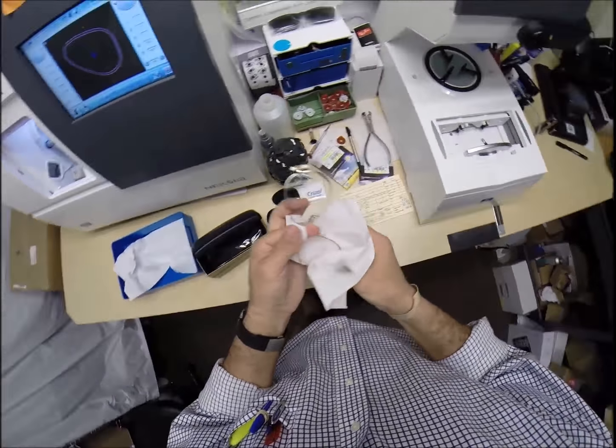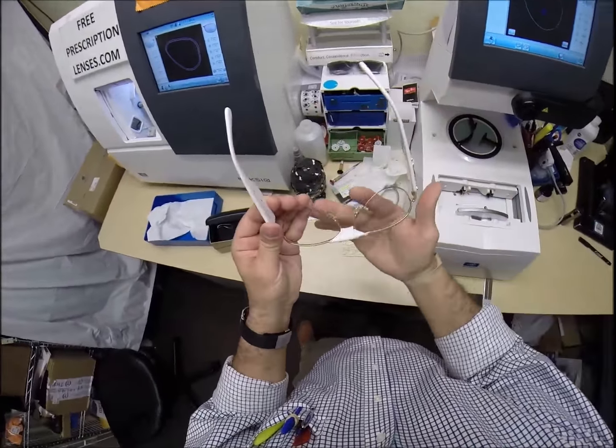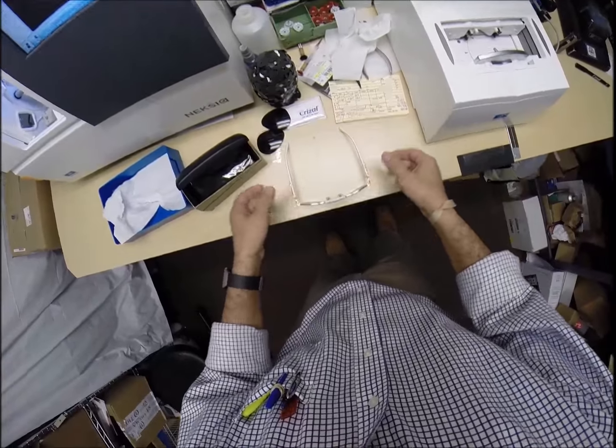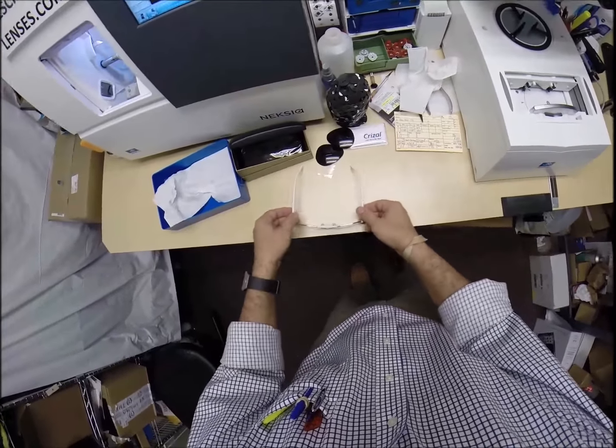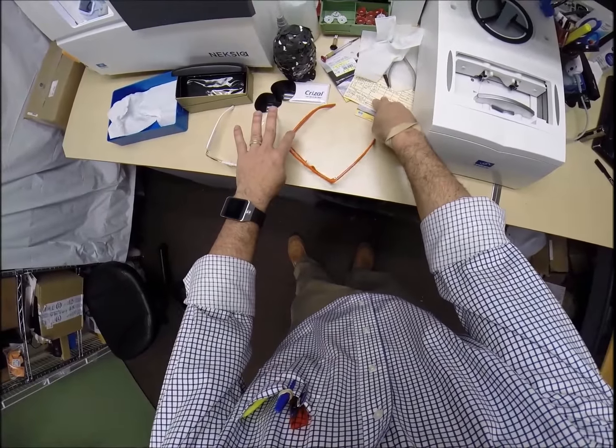But I'm going to get them in standard alignment first, also known as the 3-point stance. The 3 points are 1, 2, and the bottom of the frame being 3. I set them on the counter and press down. There is no wobble. When I say wobble, I take mine off and press down, and they wobble on the counter.